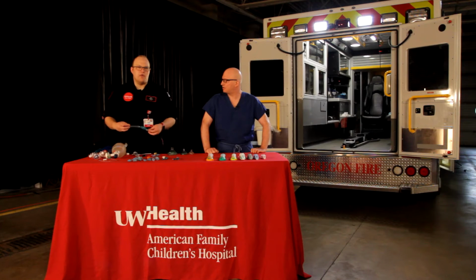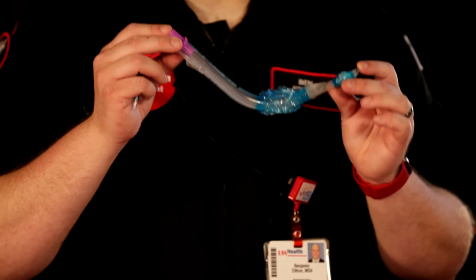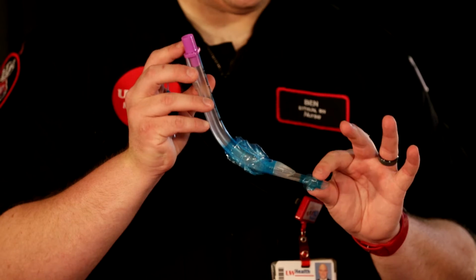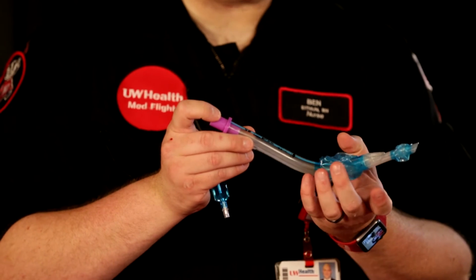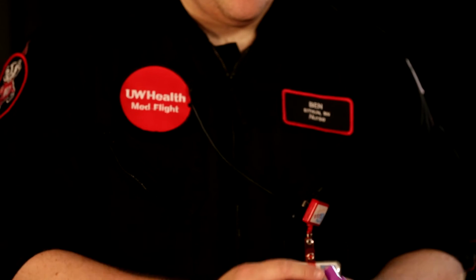And so kind of the two main ones that we see are going to be the King, and this is more similar to the Combitube that many of you, if you have the gray hair in the room, might remember, the Combitubes that we used to place. This is similar to that, but instead it only has one place to hook up a bag, and there's only one lumen. Essentially what this does is you're going to place this into the esophagus. This part is going to blow up and obstruct air from coming back out the mouth, and then there are ports that drive the air up towards the trachea.